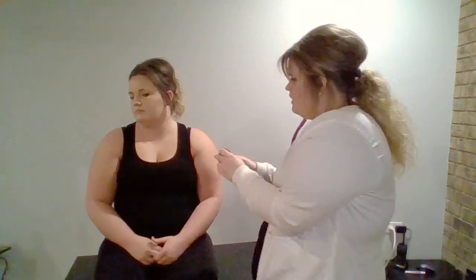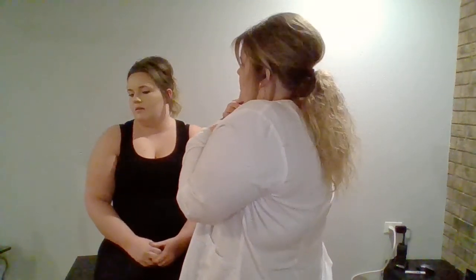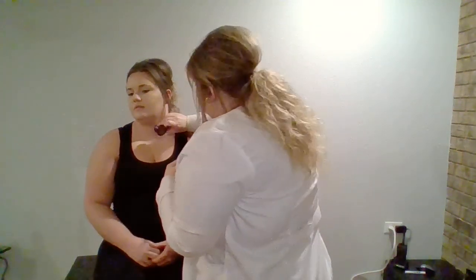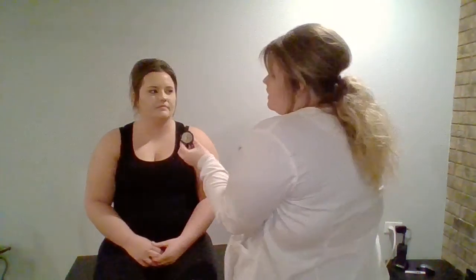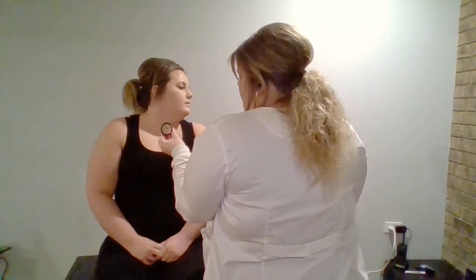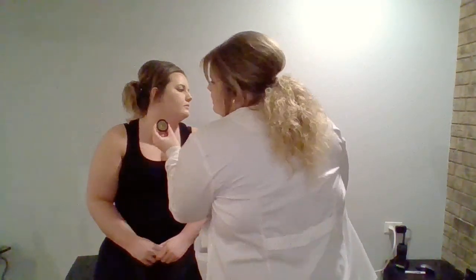So now along that, I'm going to listen for any bruits with the bell of my stethoscope. So if you can just turn your head the opposite direction against me. Okay, now take a deep breath, let it out, and hold your breath. Now hold it. Okay, now turn your head this way. Deep breath in and out. And on the out, hold it. Okay, no bruits were heard. And I used the bell of my stethoscope.